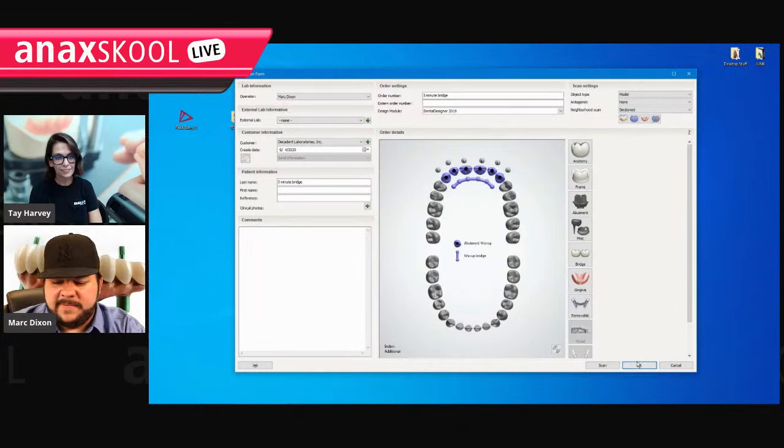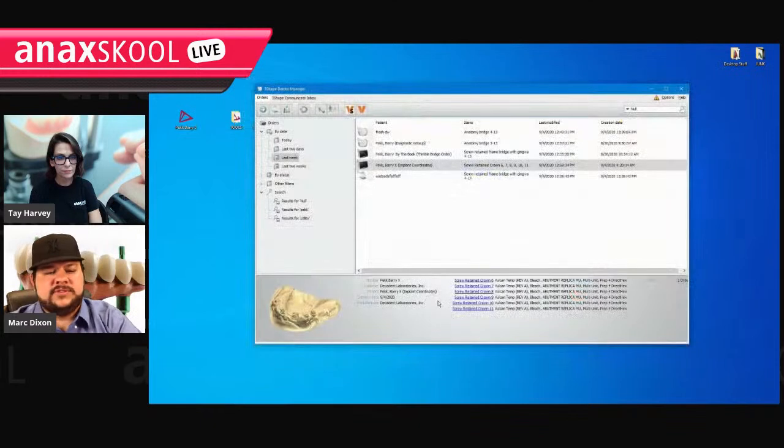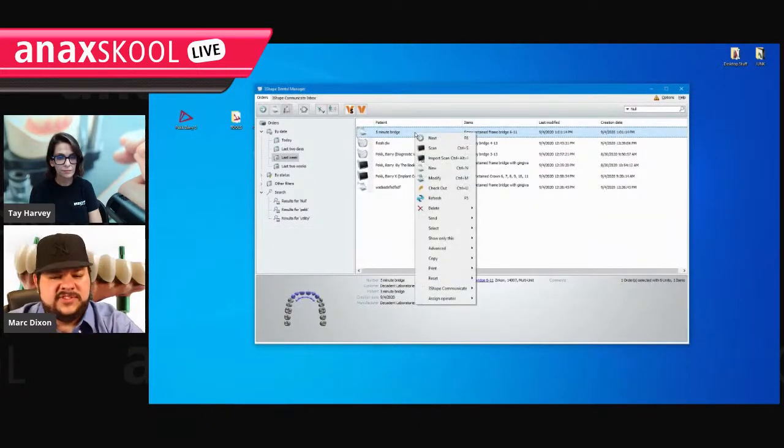Yeah. So this is our 5 minute bridge. If anybody's confused, it's simple. Choose this little last blue one for each tooth that has an implant. Choose your implant system and hit bridge. It turns into a wax up bridge, and press OK. This isn't my creation. This is Prishemic. Everybody knows Prishemic. When you showed me this 2 years ago, I haven't done it any other way since. This is how I do it now.